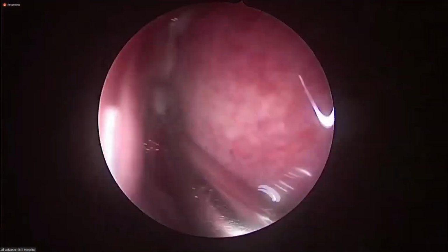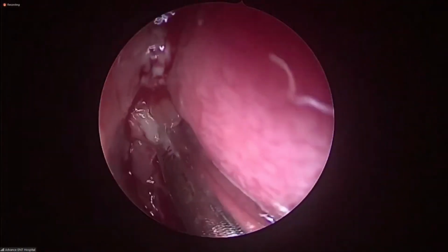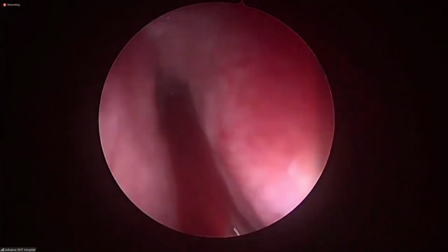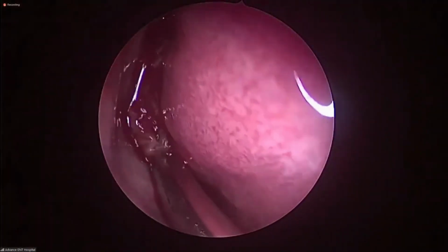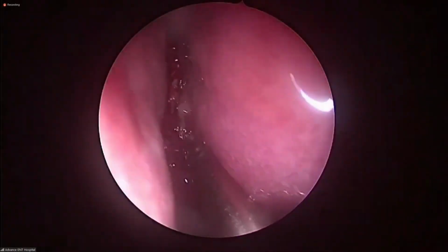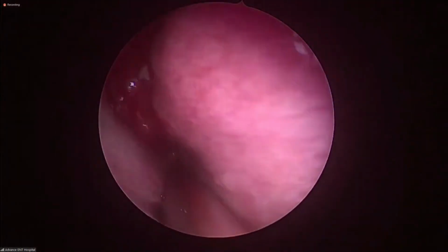Initial debulking is required, sir. The polyps are looking infected also. High DNS, sir. Yes, high DNS, infected polyps.